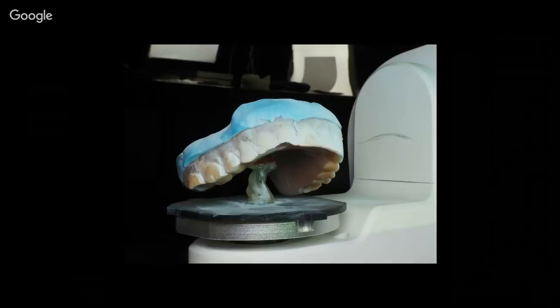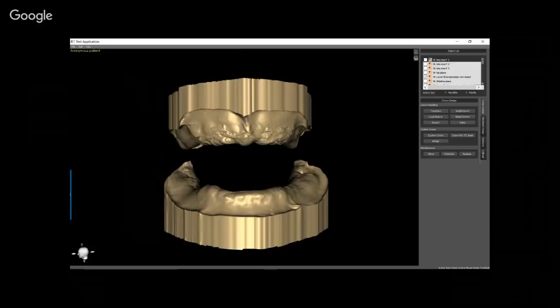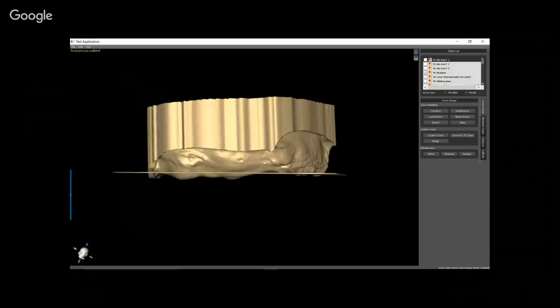So I scan them articulated. Remember, rubber band them together and scan them for a buccal bite. Then I will use some Triad gel, or whatever material you want, sticky tack, it doesn't matter, and I'm just going to try to orient this base where the scanner can see the entire interior of that denture, as well as some of the buccal surface for stitching purposes. And here are the resulting models, perfectly occluded, really detailed tissue models.